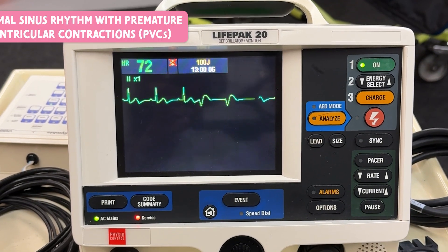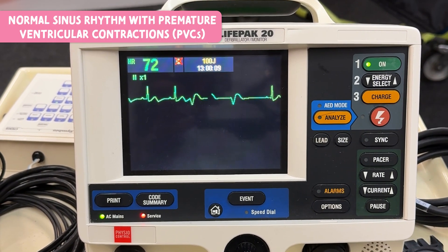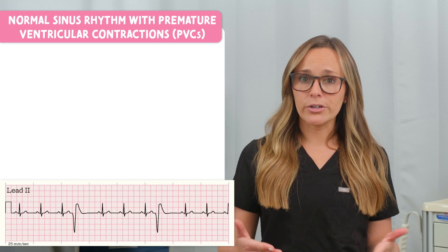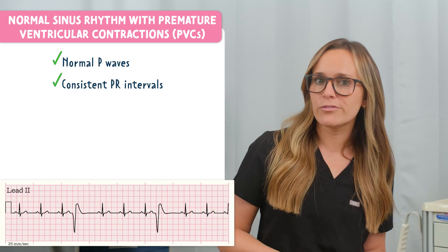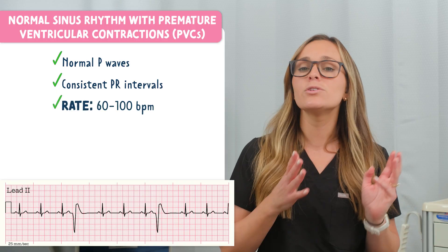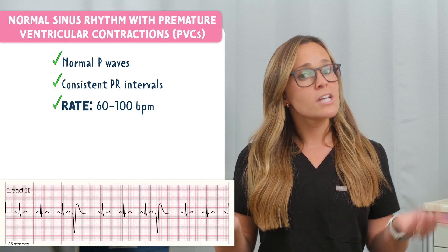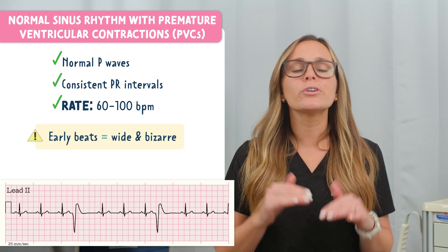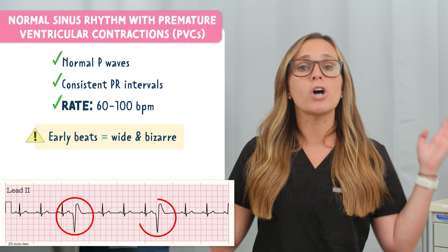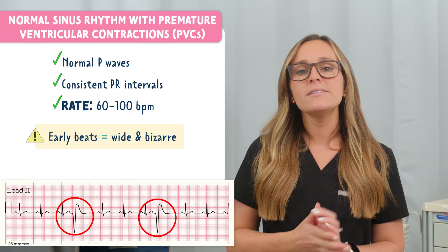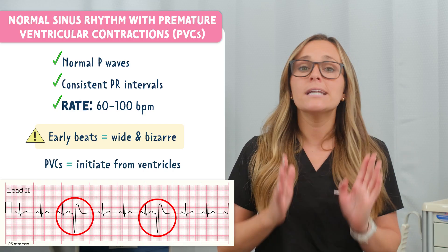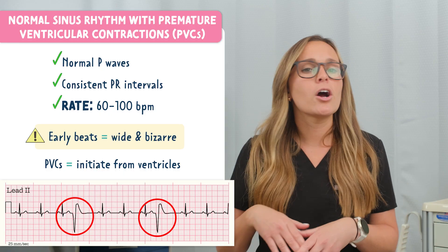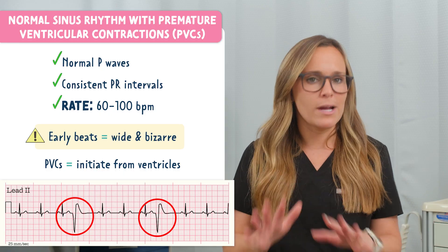This is normal sinus rhythm with premature ventricular contractions or PVCs. The underlying rhythm is regular with normal P waves, consistent PR intervals, and a rate of 60 to 100 beats per minute. But what stands out are those early beats that are wide and bizarre looking — that's the PVCs. PVCs come from the ventricles, not the SA node, so they don't follow the typical conduction pathway and are randomly interrupting the regular rhythm.